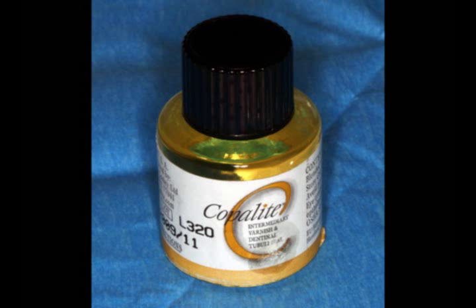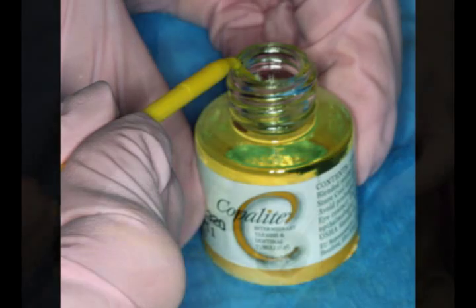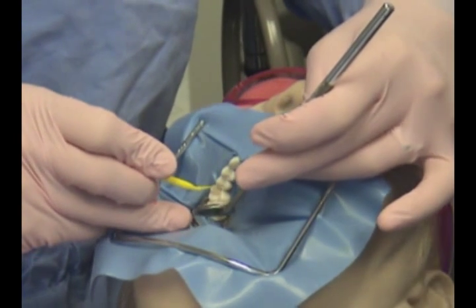Copalite will now be placed into the preparation. The Copalite will be transferred to the preparation by using a small applicator. The applicator is now transferred to the operator for placement.